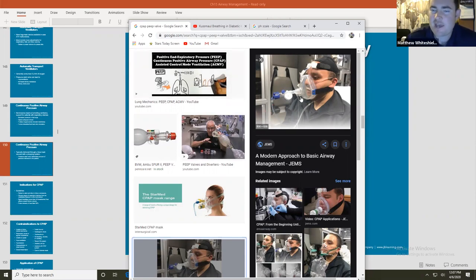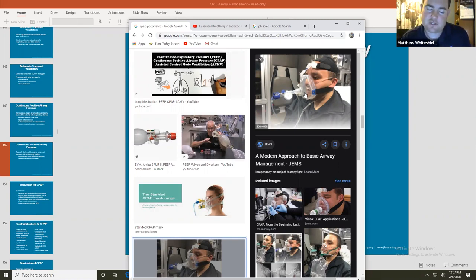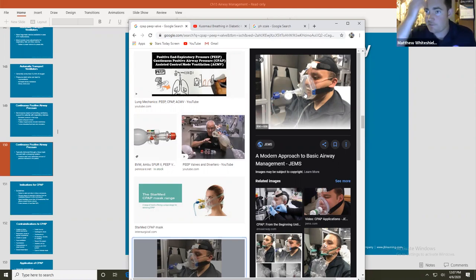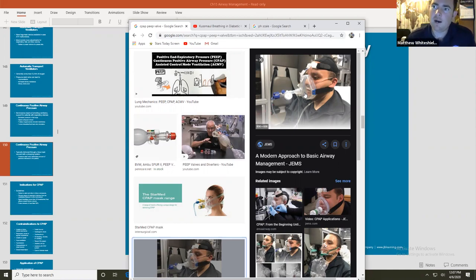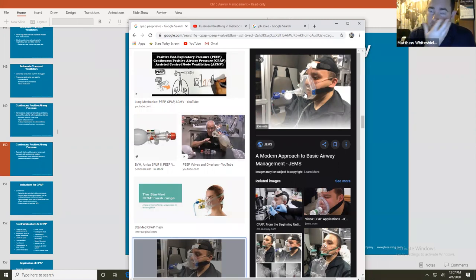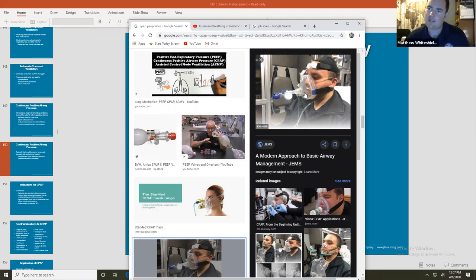When placing CPAP, I turn it on first — I'm probably going to start at around 10 liters per minute. I put the CPAP on the patient's face. I never apply a CPAP on anybody's face if air is not flowing. If you want to talk about claustrophobia and people freaking out, put a CPAP on somebody's face without O2 flowing.